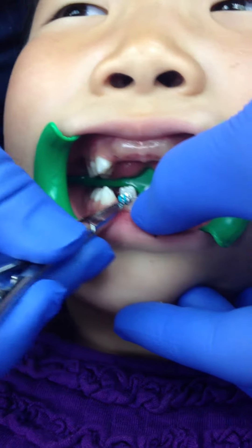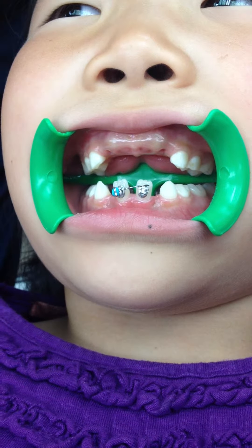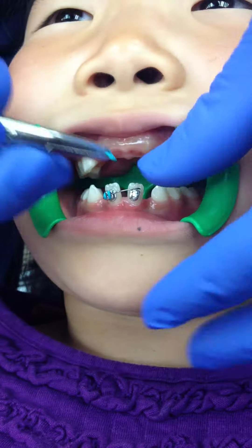They fit over very easily, just like that. So it is now active on that tooth, and I'm going to go ahead and put one on this other tooth over here.